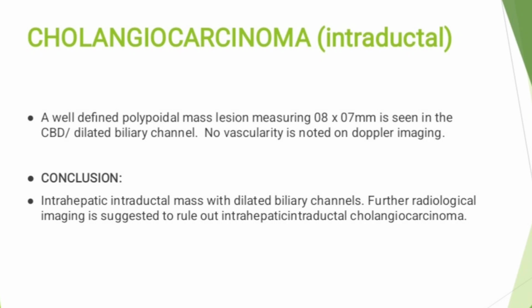The report should include that a well-defined polypoidal mass lesion measuring this much, whatever the measurement is, is seen in the CBD, and dilated biliary channel. It may occur in both areas, within the CBD or within the dilated biliary channels. So also put the Doppler on it, and if no vascularity is noted on Doppler imaging, say so, and if there is any vascularity, mention that the vascularity was seen on the Doppler imaging.